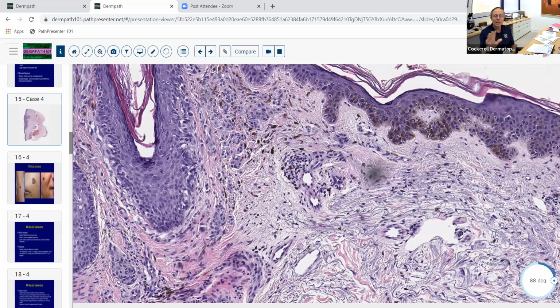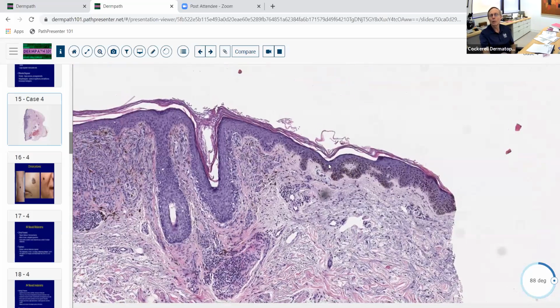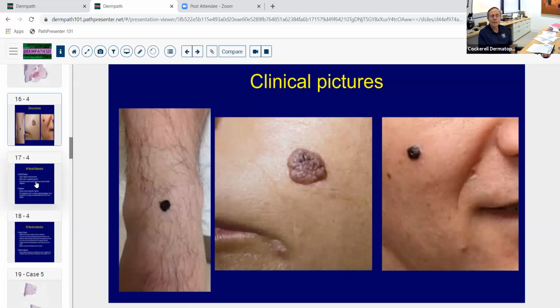So you're not going to get this on the exam, but it's not all that hard to diagnose really. On a scale of 1 to 10 for a dermatopathologist like me and others, it's going to be about a 1. It's not going to be a 10 in difficulty. We would easily call this a melanoma, but it's got a few unusual features, and that's probably not what you're going to see on the exam. That's one of the reasons we want to show it to you, to realize that sometimes melanomas can look nevoid.